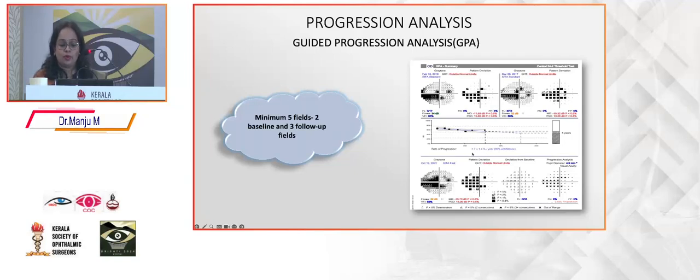This is the rate of progression of the patient. So the visual field index is there, mean deviation is there, all is written, and you can have progression analysis either by the visual field index or the mean deviation. The visual field index of all the visits will be recorded, and the machine can extrapolate this data over 5 years and tell us, if the patient is having the same rate of progression over 5 years, what can be the patient's visual field index after 5 years. So it can tell you whether you need more intervention at this point of time.